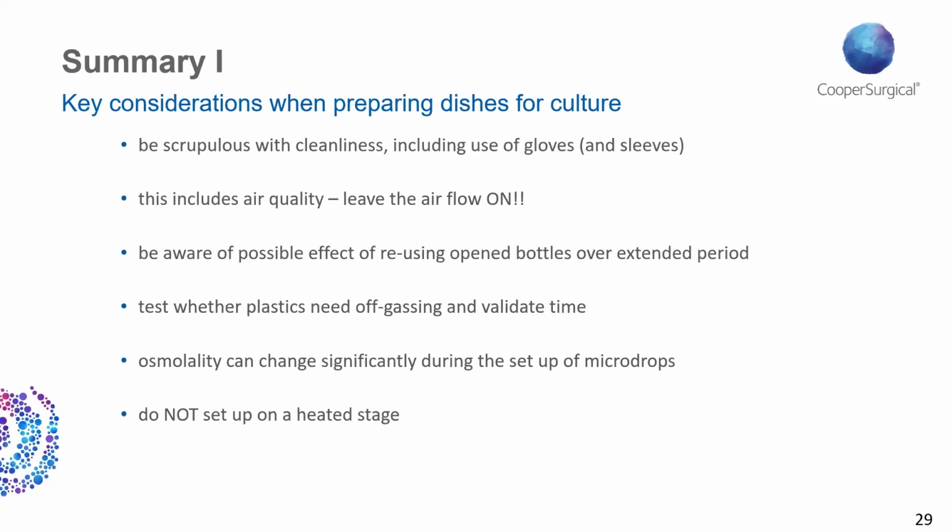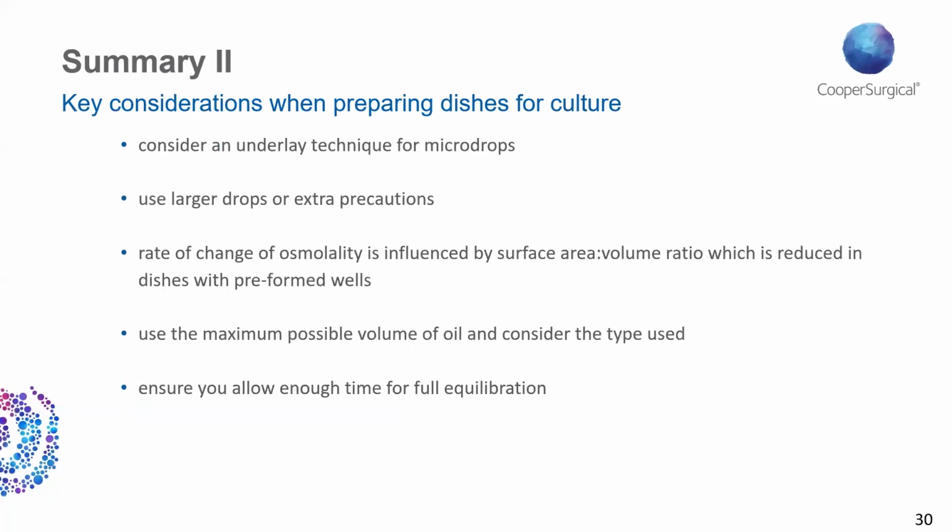Osmolality can change throughout culture, but it can also change during the setup of the dishes. So again, you need to be aware of that when you're making the dishes, how you make them, and make sure that that's done effectively, and not use a heated stage, do it at room temperature. That's critical. And then the next summary, consider that underlay method. So where you put the drops in under the oil where a drop has already been, that helps with reducing evaporation risk.